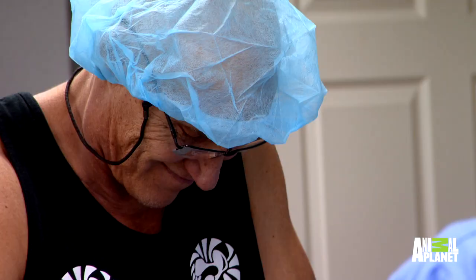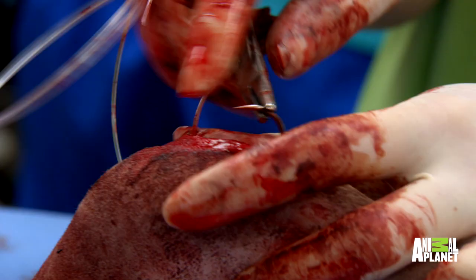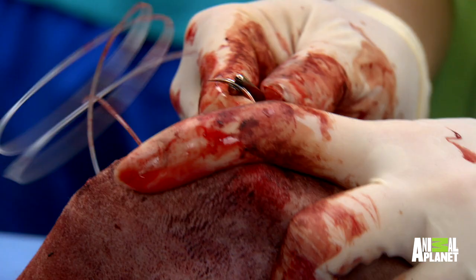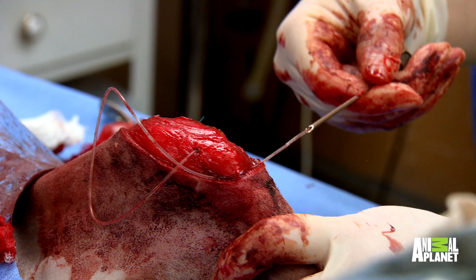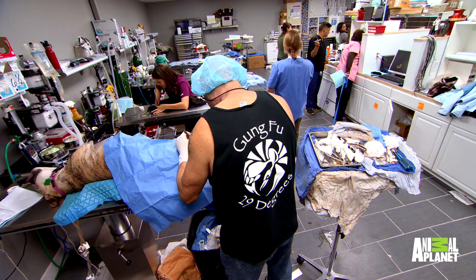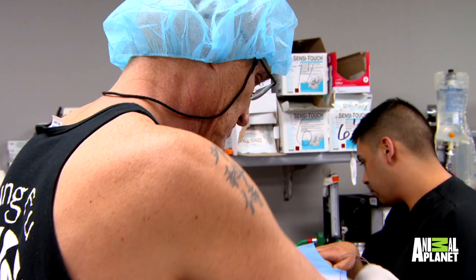This is the part that takes a little bit of power. The artificial band forms a figure right around the knee and basically mimics what that ligament does, so it stabilizes the knee.